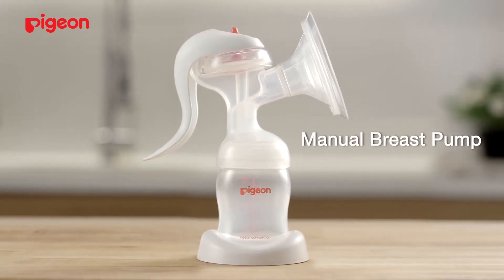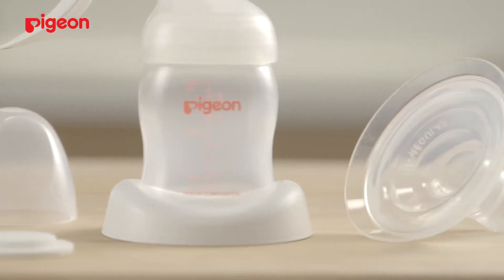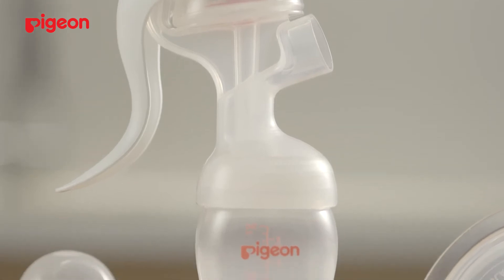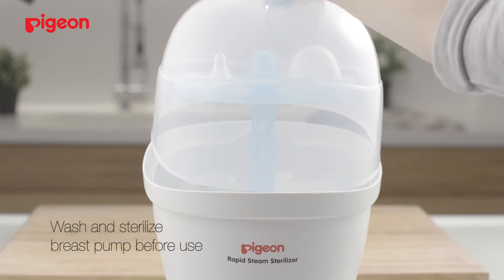Breastfeeding is a beautiful part of life. But you may feel overwhelmed looking at all the parts. Follow these few simple steps and you'll be good to go. Before use, wash and sterilize the breast pump first.